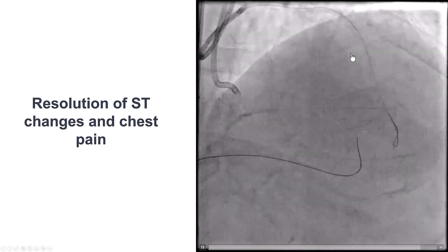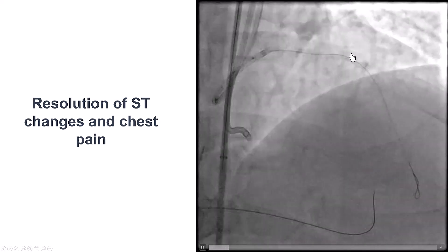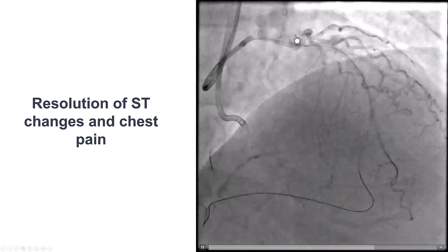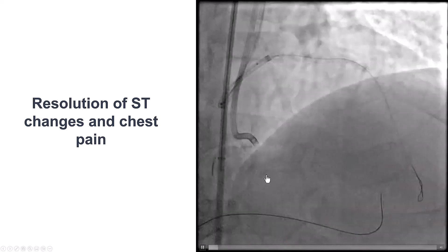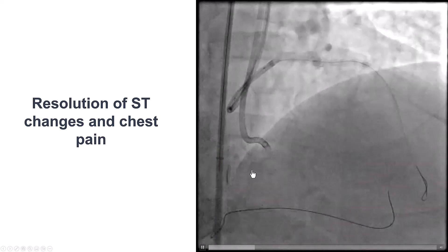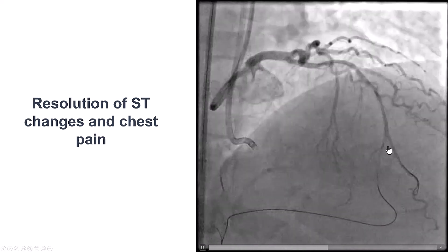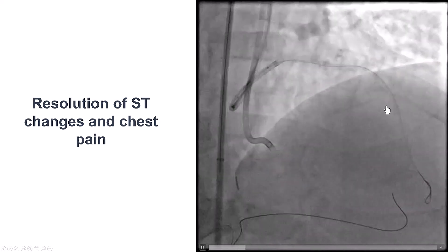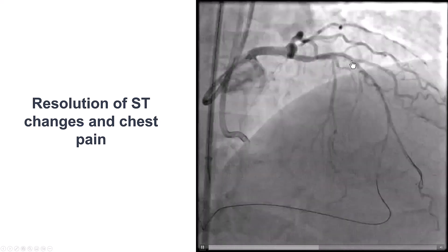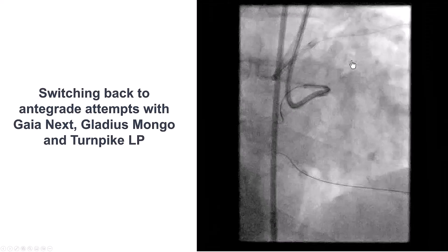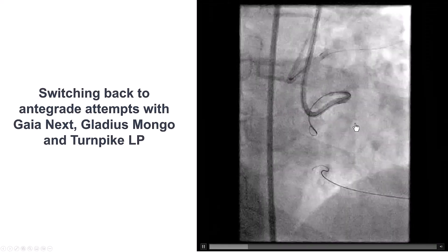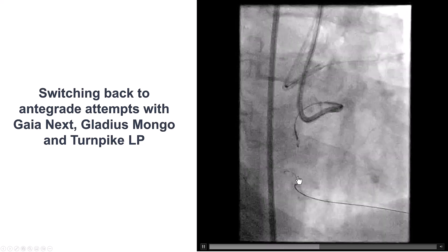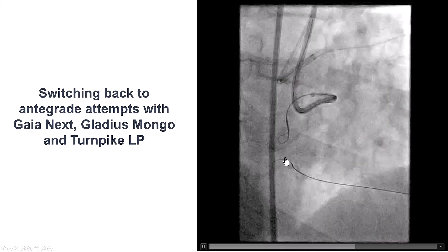We did an angiogram to verify that we did not have any dissection, thrombosis, or other problems in the donor vessel, and the donor vessel was appearing okay. Very importantly, we did have a safety wire in the LAD, which can be literally life-saving in case of a donor vessel complication. At this point, without a retrograde microcatheter, our penetrating capacity was very poor on the retrograde wire.